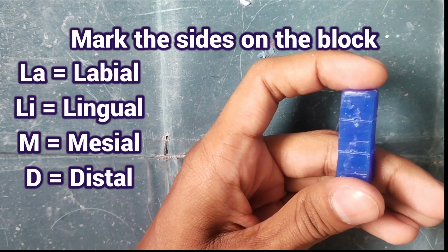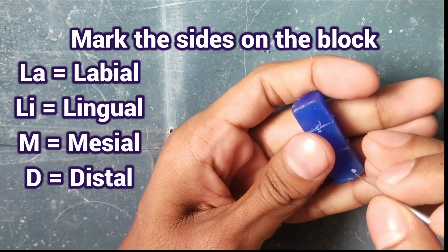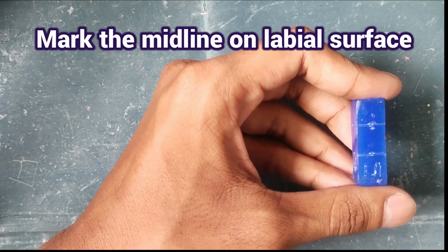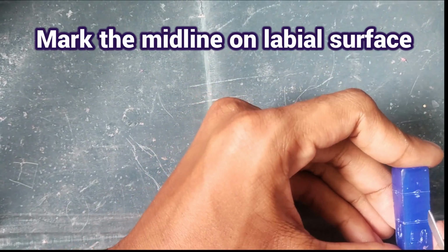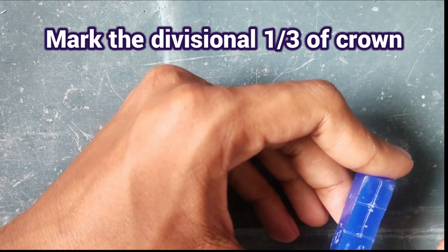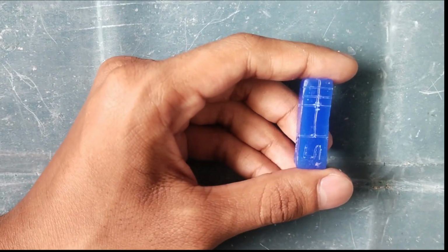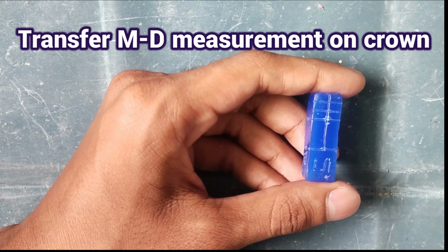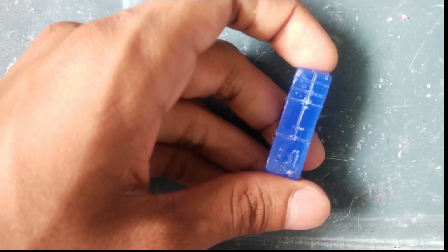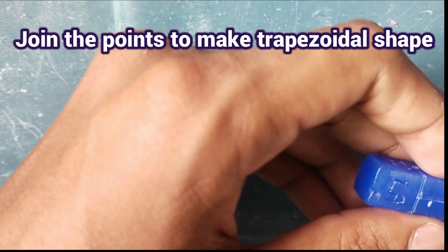Now mark the labial side, lingual side and the proximal side. Now mark the midline at the labial surface. And divide the crown into the thirds. Now transfer the mesiodistal measurement, which is 8.5 at the incisal third and 7 mm at the cervical line. Now join the points to make the trapezoid.